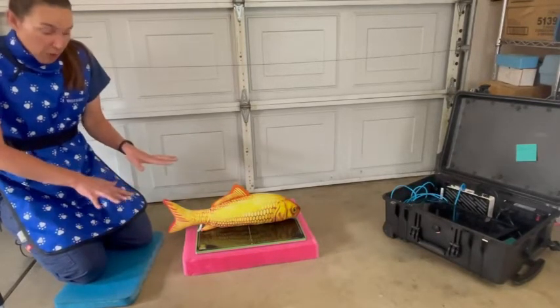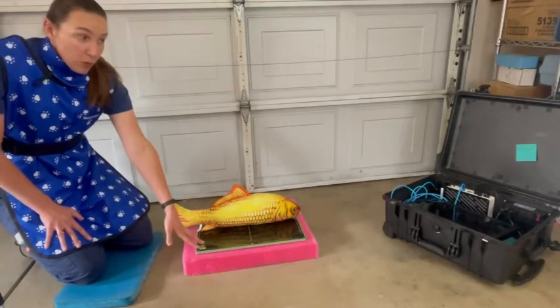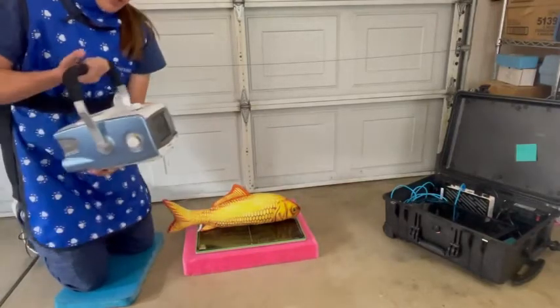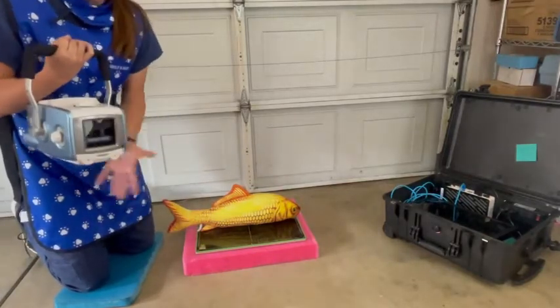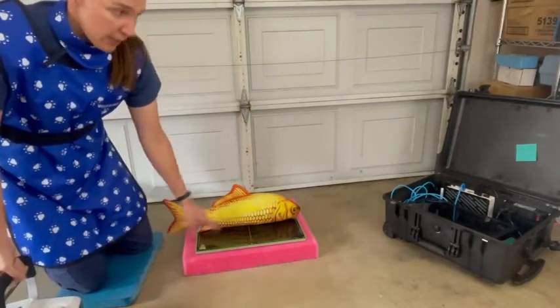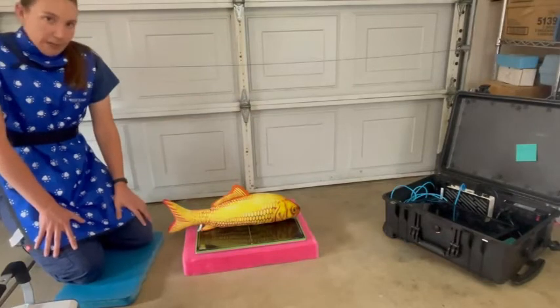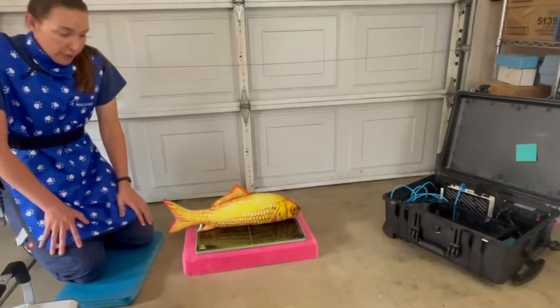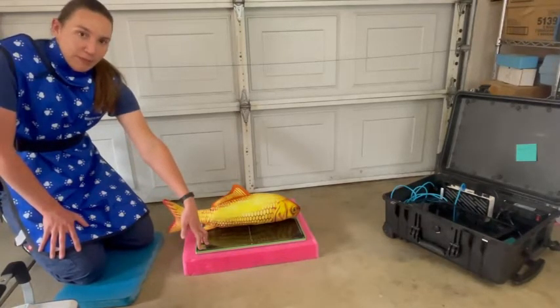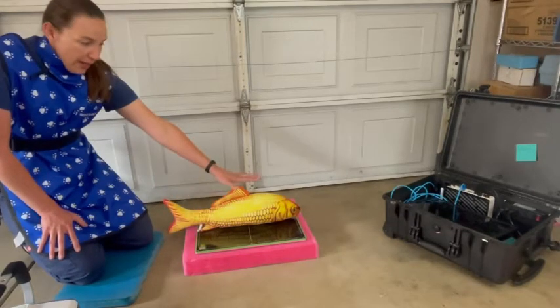The fish is going to be immobile the whole time, sitting on a plate here. We use a digital x-ray system, so basically this generator here is going to fire — again, not plugged in, not on — the x-rays into this plate that the fish is sitting on, which is going to be interpreted by the box over there. For this demonstration there is no water involved, so usually this plate would be covered in a plastic bag. We don't have the waterproof system because this whole unit was expensive enough.